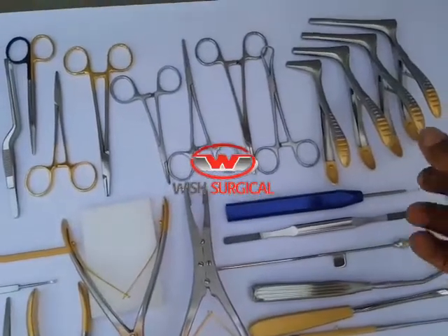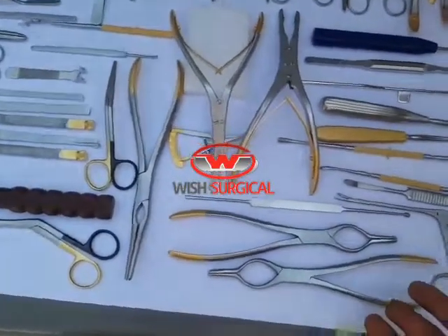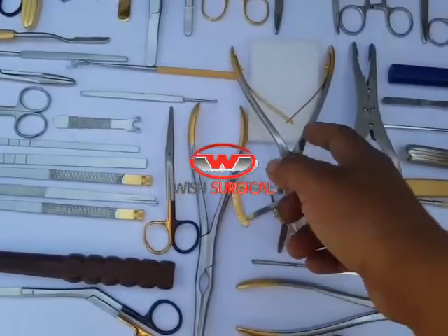You can also see a Killian speculum set of four pieces with different sizes, Frazier suction tubes, Wilsham forceps, basic forceps, and Walsham forceps. Here you can also see Castroviejo calipers.